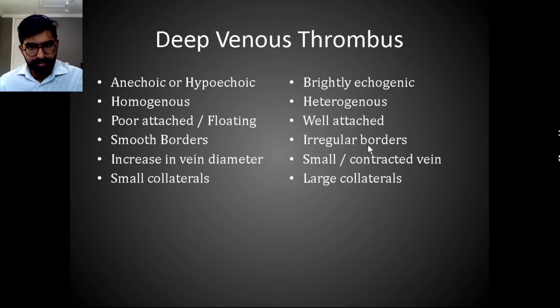So these are certain characteristics that we talk about and how you differentiate between acute and chronic. And many times it's very, very difficult to find out if it is acute or chronic, and usually the history of the patient helps you determine this. There can be some age indeterminate DVTs, and I think, again, talking to the patient, finding out the onset of symptoms, as well as looking at some of these findings does help you differentiate between the two.